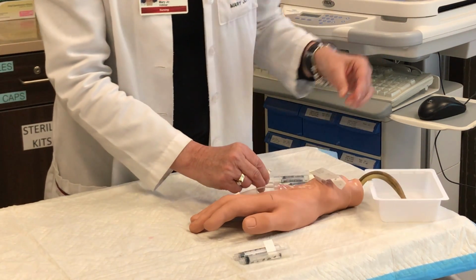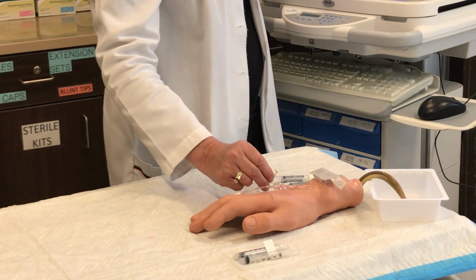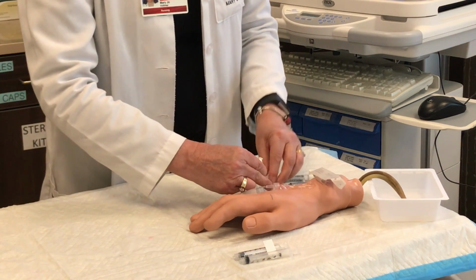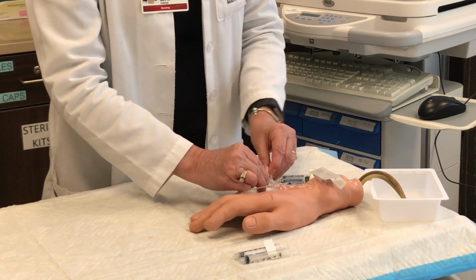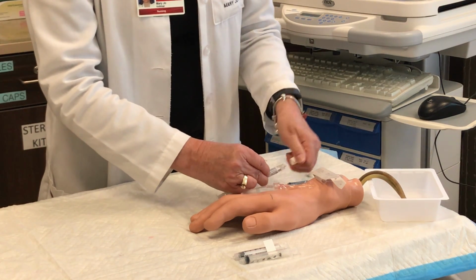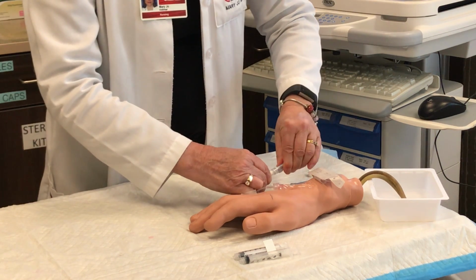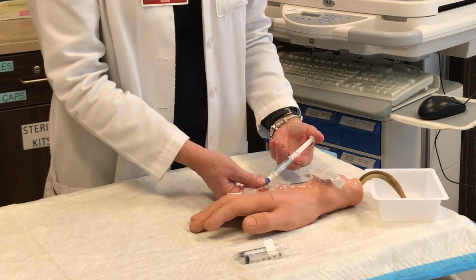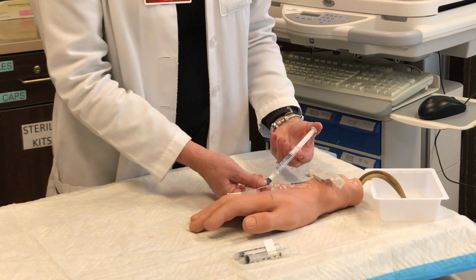Break seal on second normal saline flush and purge air from syringe. Cleanse INT port per agency policy. Again, if I did not prepare my saline as I did with my checks with the 5 rights, I would be expelling that air and adjusting the amount of saline in the syringe at this point. Attach normal saline flush syringe into INT port. Inject flush at same rate as medication administration for 1 ml. Slowly push remaining flush. Observe site for infiltration. Reclamp INT per agency policy and remove syringe.